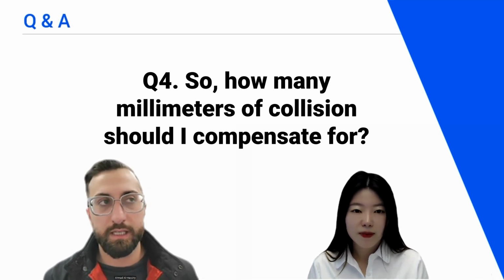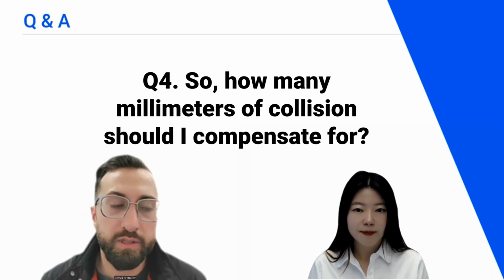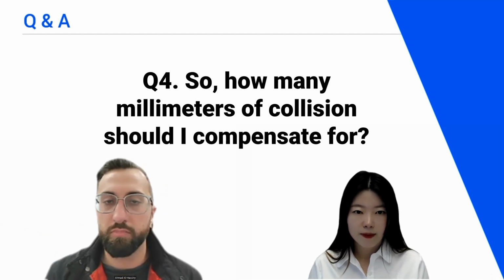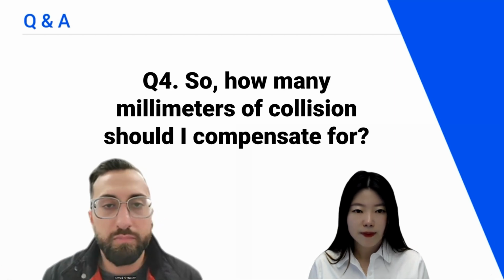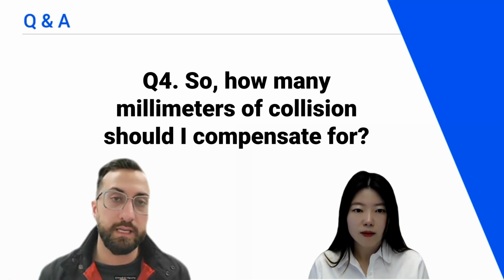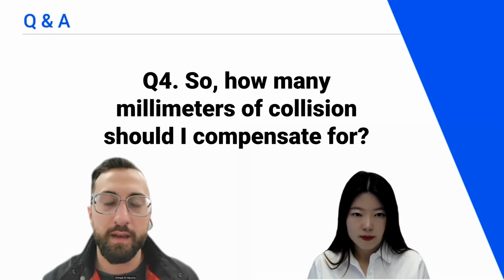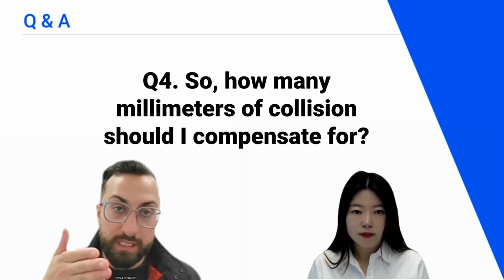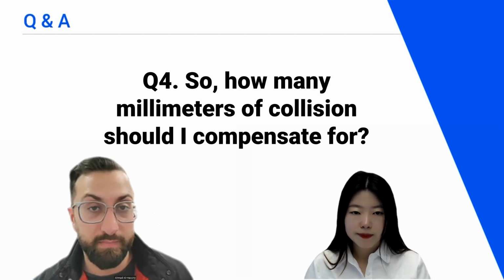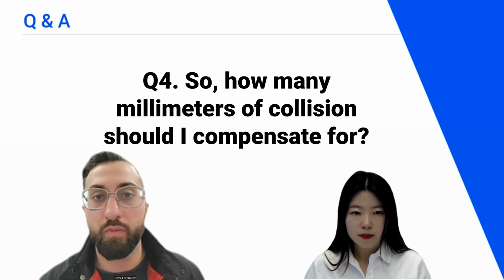Yeah, and it's like what I was mentioning, intersections are probably the most common error that happens with bite scans. And as I was mentioning, if it's a few little spots throughout the bite scan, I'm typically okay with this. But if it's a significant intersection, and you will see it, it's not about millimeters, but you will see it. If you just turn the bite scan around so you can see through the underside of the scan, as I was showing you guys, and you see a lot of intersection, that is when red flags arise.